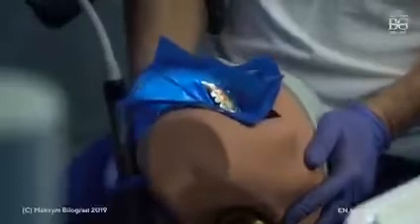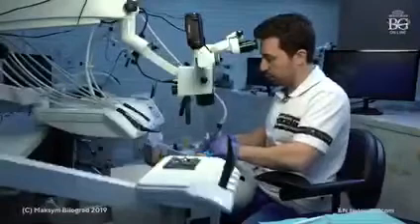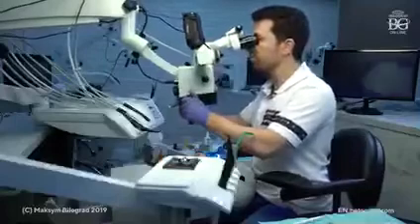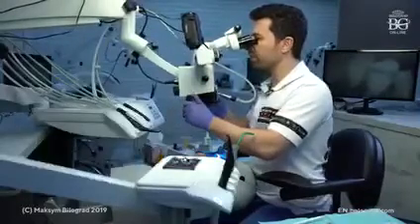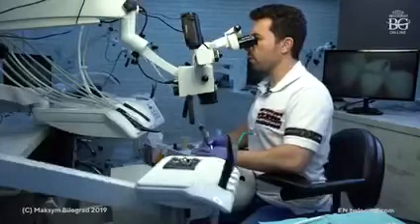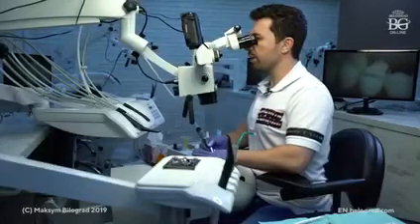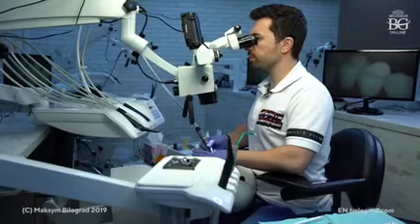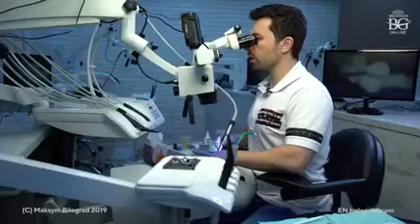Okay, now we will make this buccal surface also smooth. We will ask our patient to move chin up. Okay, or we will move our microscope forward also, because that will help us to see the occlusal surface. Okay, so now we will just modify that preparation, make it really smooth with the red burr. Same with the buccal aspect.